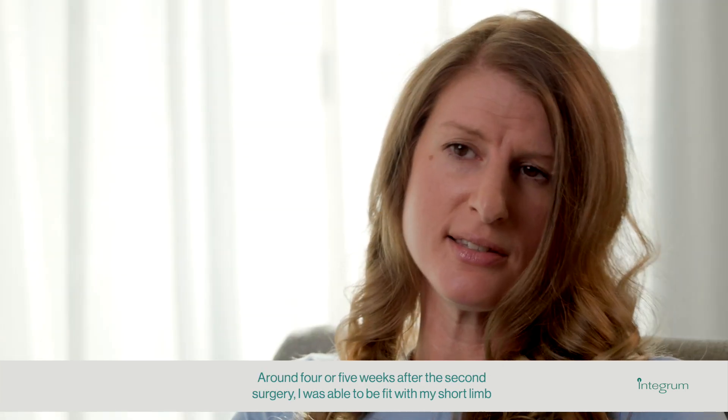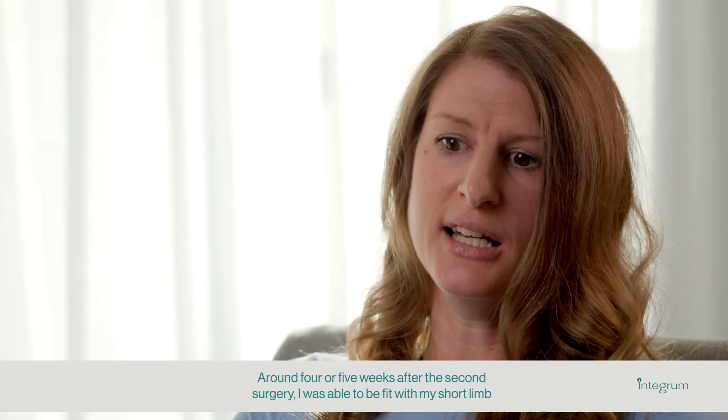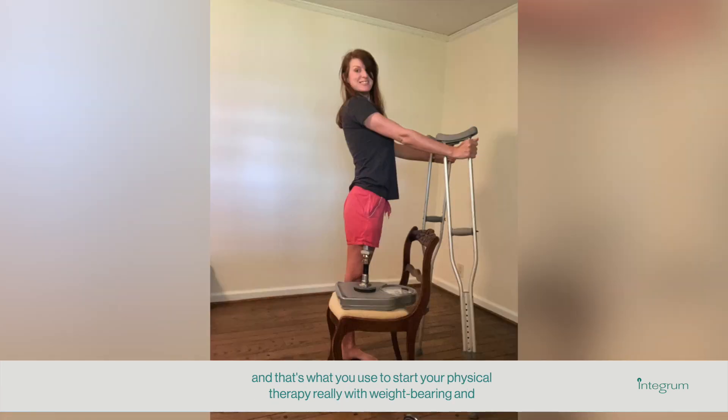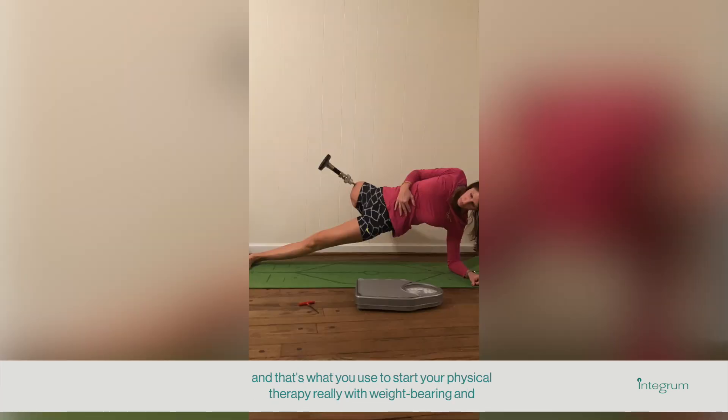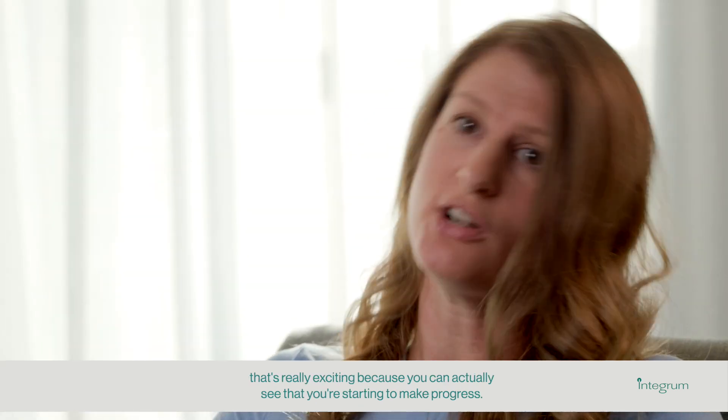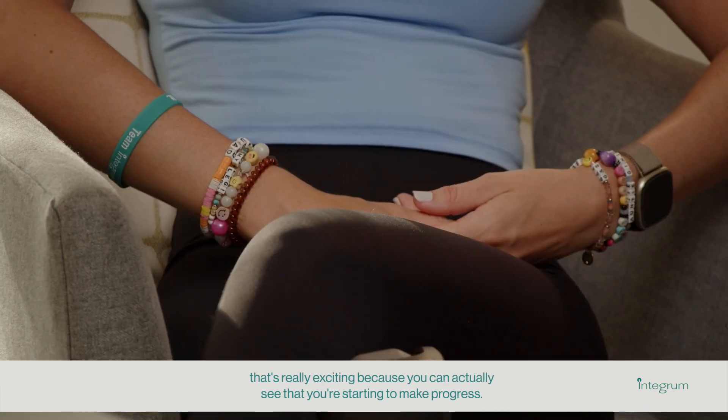Around four or five weeks after the second surgery, I was able to be fit with my short limb, and that's what you use to start physical therapy with weight-bearing. That's really exciting because you can actually see that you're starting to make progress.